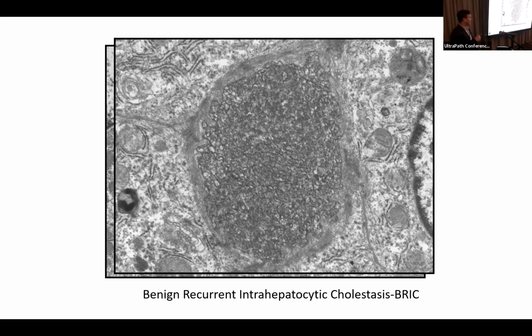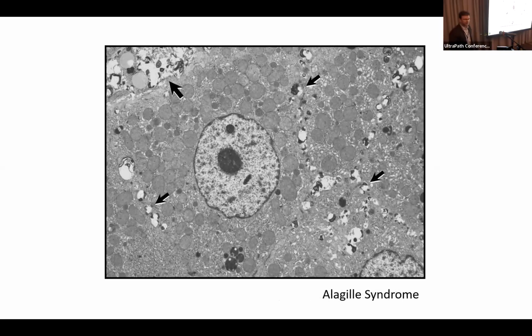So when we see this kind of Byler's bile, it's usually because one of the reasons we get a biopsy is neonatal cholestasis. Typically, if they've ruled out biliary atresia, which is the first thing that you do, then it's got to be something else. And so one of the questions they're asking us is, could it be PFIC? We'll be looking to see if this bile looks like that, but that wouldn't be true for PFIC2 or PFIC3.